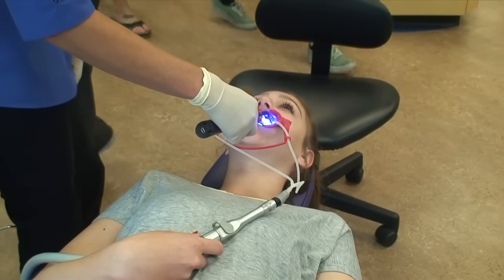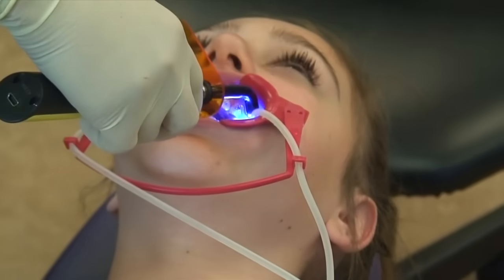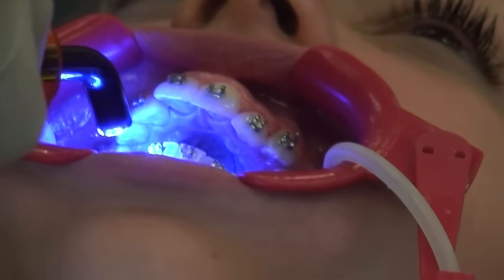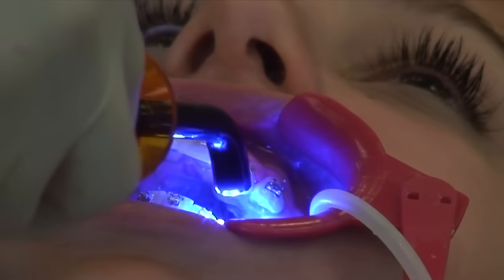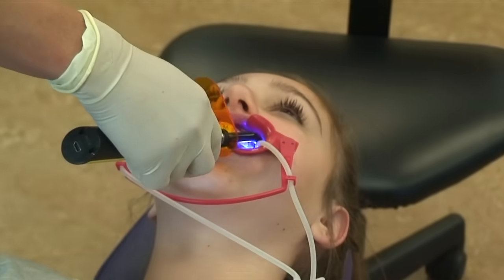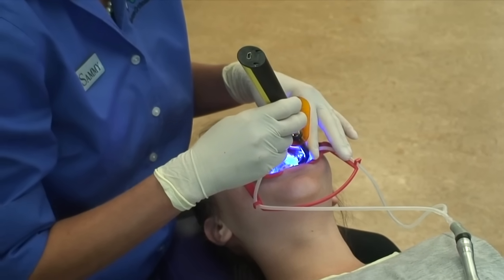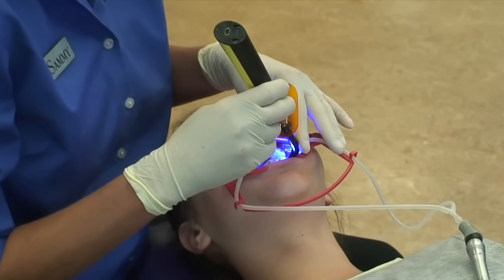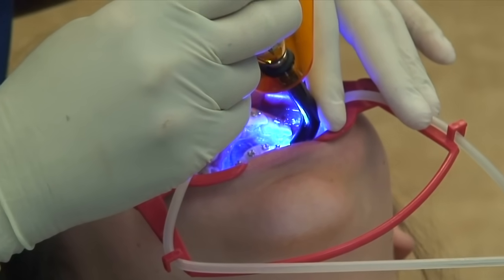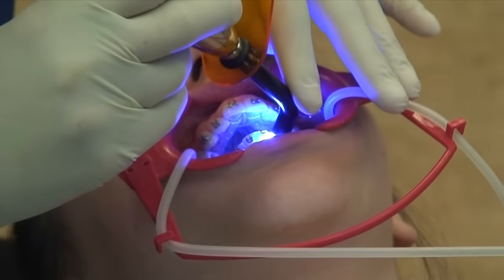Now here you see the special light. It's within the visible spectrum, so it's not a laser or anything like that. There's no heat that's generated from it. It's just a very intense light that acts as a catalyst to make the glue harden. Each bracket needs to be cured approximately 10 to 15 seconds, and we move on one bracket at a time. And you can see as we finish moving the light across the glue, that bracket is then set and it becomes a permanent fixture on the teeth until we decide to take that bracket off.